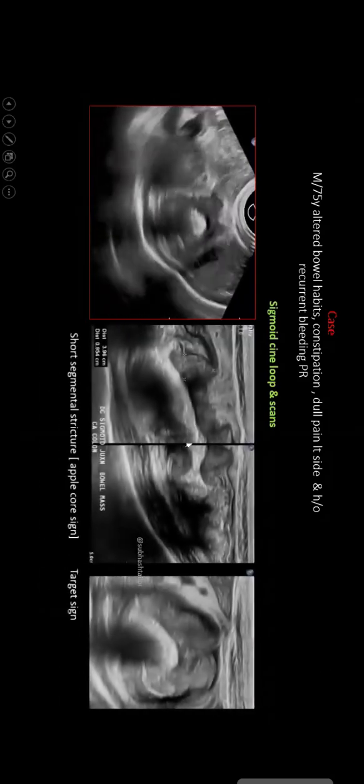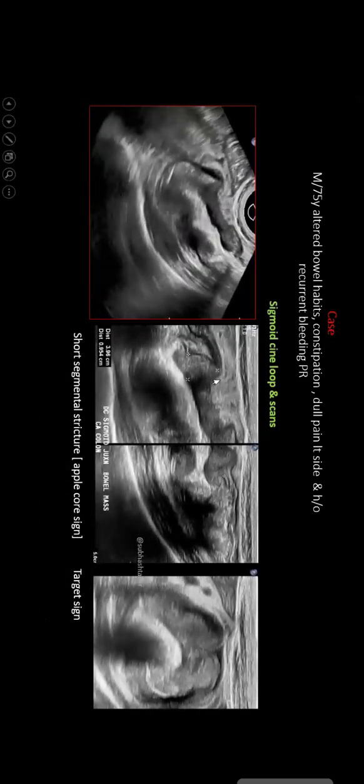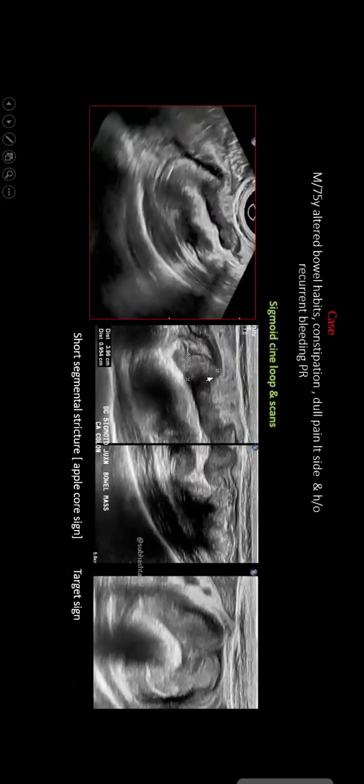So this is a short segmental hypoechoic mass, luminal narrowing, gut signature loss, shouldering, with a short, narrow zone of transition. Now see the high resolution images. Transverse, there is a target sign. So there is an abrupt mass, shouldering. So there is a short segmental stricturing mass of the sigmoid colon, target like in transverse. See the beauty of the high resolution scan showing how much of the segment is involved. This is the luminal narrowing. This is the mass, gut signature lost, shouldering, short segmental, neoplastic, adenocarcinoma of the colon causing a stricture or stenosing lesion. Typical apple core mass.